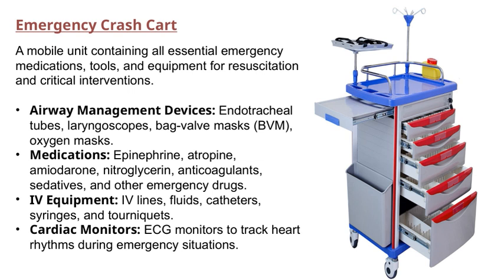Finally, the cart features cardiac monitors, such as ECG monitors, which are indispensable for tracking the heart's rhythms during resuscitation efforts. Continuous monitoring helps us assess the patient's response to interventions and guide our ongoing treatment. Overall, the crash cart is designed to ensure that we have everything at our fingertips to act swiftly and effectively when every second counts in emergency situations.